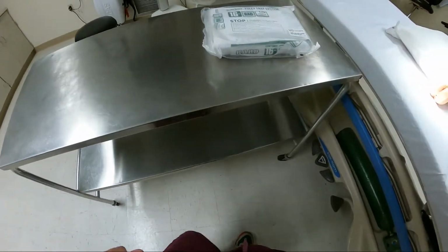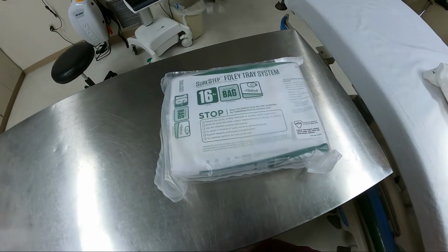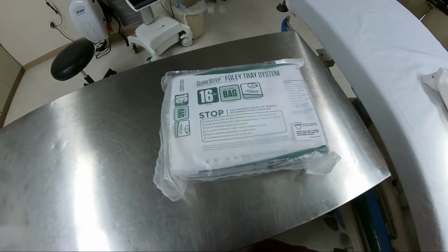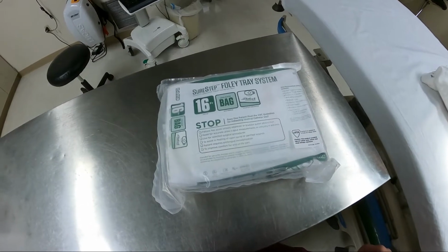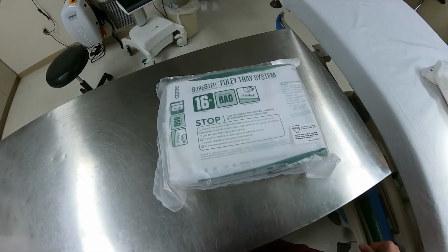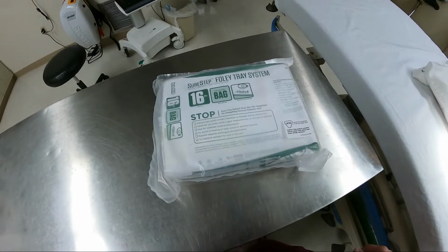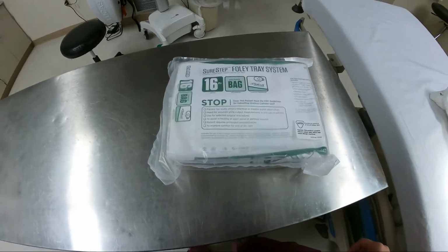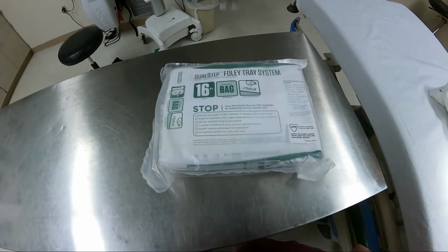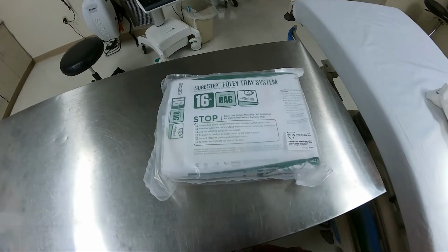Okay, so we're going to talk about CAUTI, or catheter-associated urinary tract infection, which is considered a condition that is given to you by bad health care and it doesn't get paid for, plus it can kill your patient. So it's rather important that Foley catheters are inserted only when needed and correctly.